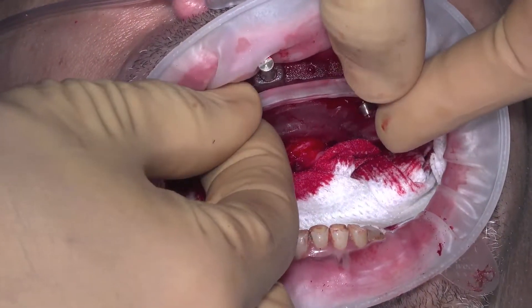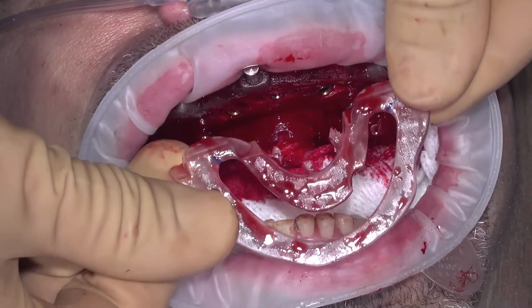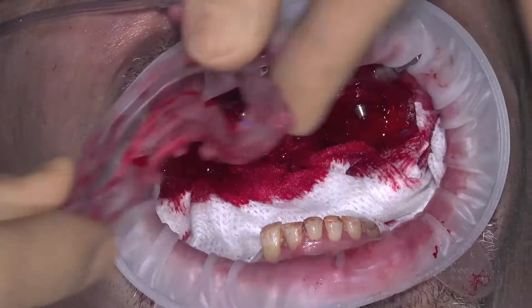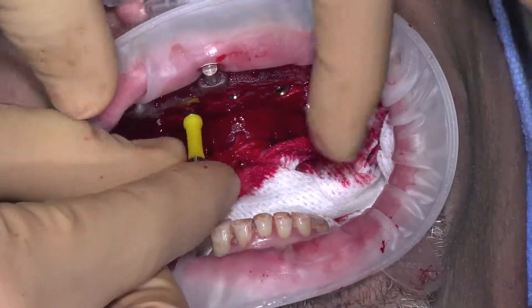Once all the angled multi-unit abutments are seated and tightened into their correct position, remove the angle rotation guide and begin to seat the straight multi-unit abutments. Most straight multi-unit abutments have a plastic carrier attached to them to allow delivery directly into the implants.